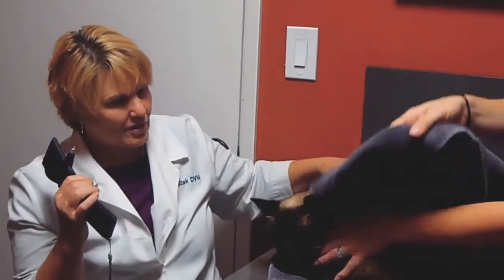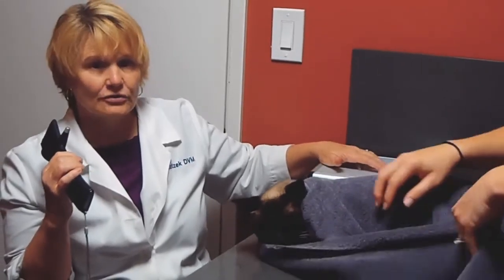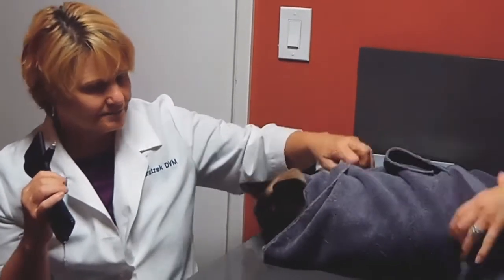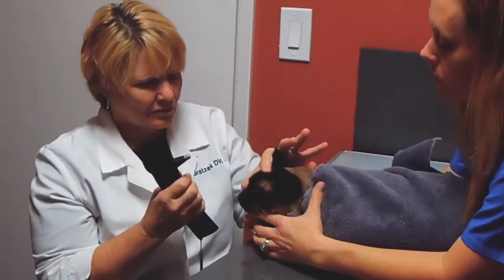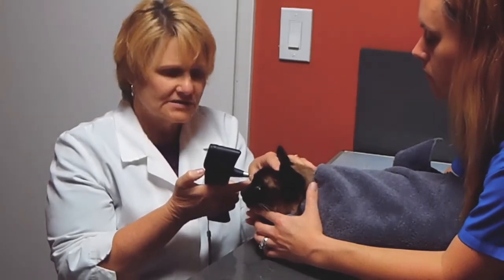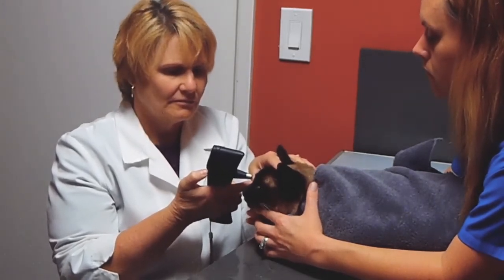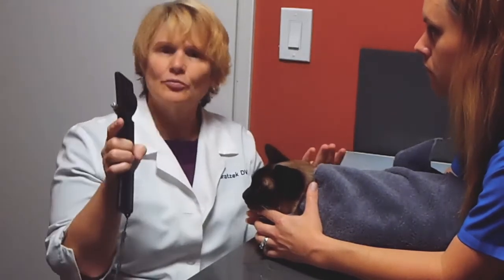We're going to wrap our Bubbles in bubble wrap. My assistant is going to elevate her chin with no pressure around the neck. I'm going to gently open the lids. We hit the button six times — notice it doesn't bother her at all.